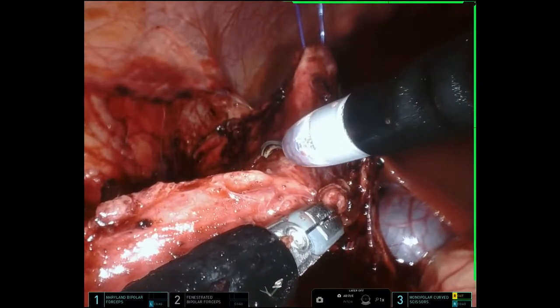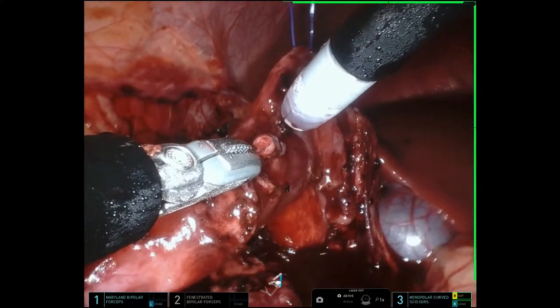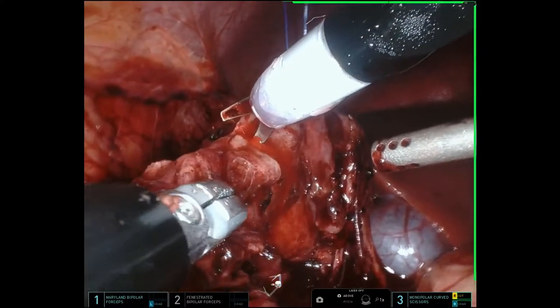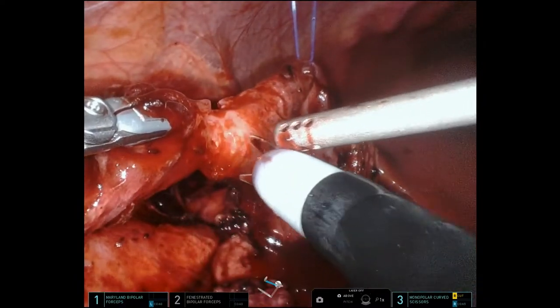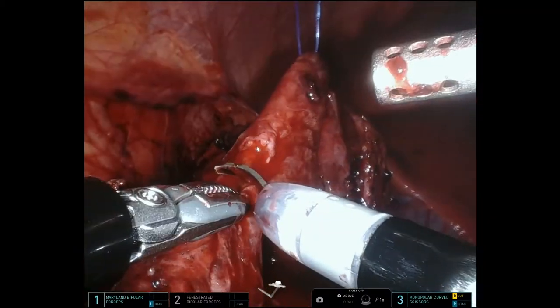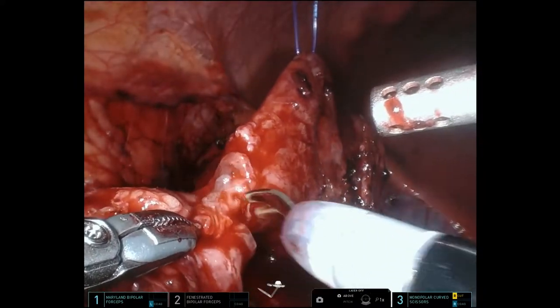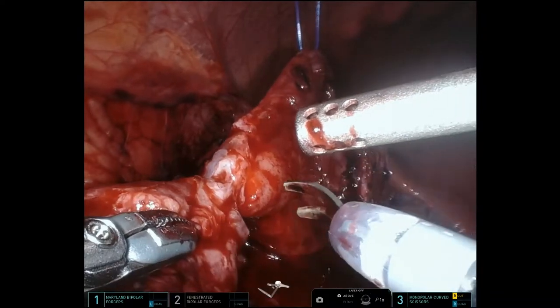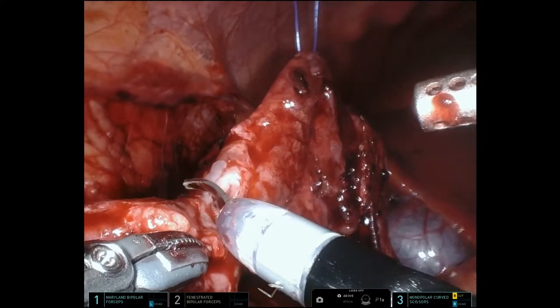This is just marking out the anticipated diamond-shaped dismemberment and then dismembering the renal pelvis and proximal ureter. There was a substantial inflammatory rind surrounding the ureter, so we had to cut down to the ureter for quite some distance to actually reach ureteral tissue. Barely inside the ureter there — now opening it up. Still can't see the stent; that's how narrow this strictured and injured segment was.